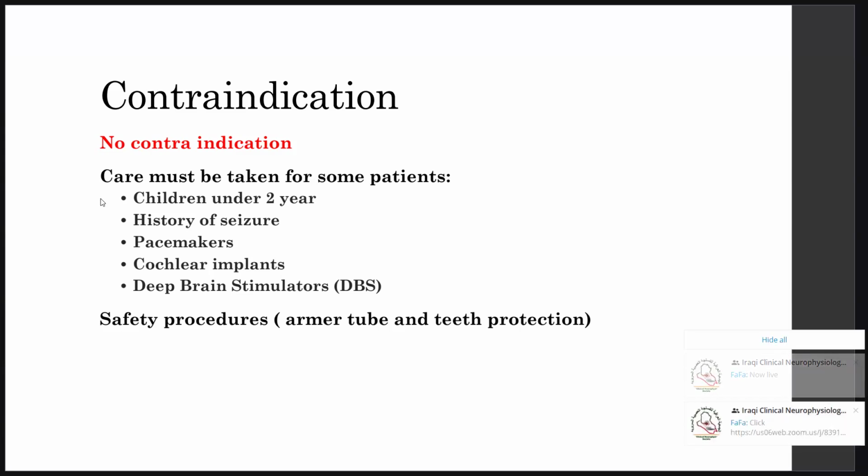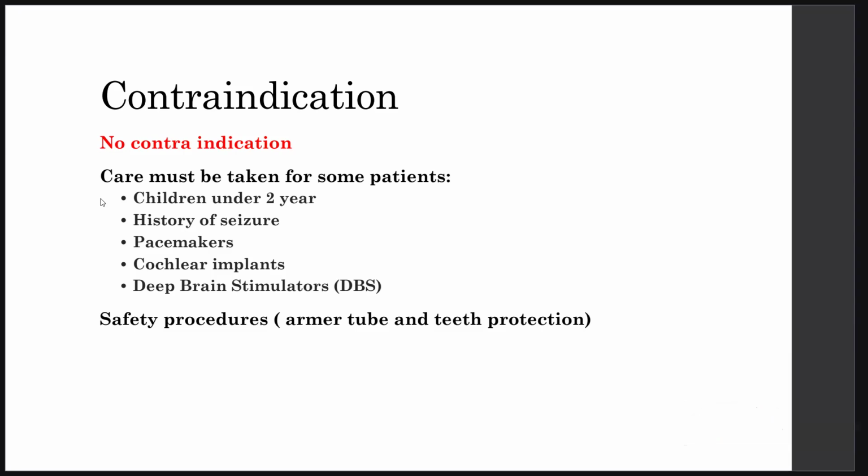You should take care in cochlear implants. With these patients, you will have to turn off the devices, as with vagal nerve stimulation, deep brain stimulators, and so on.